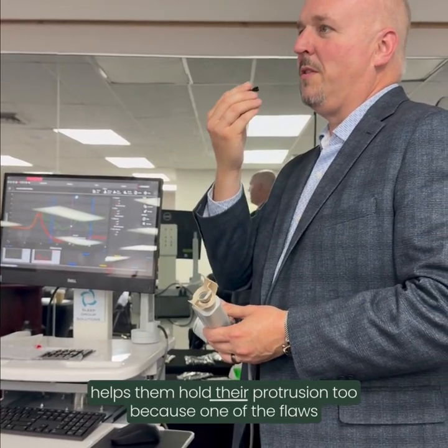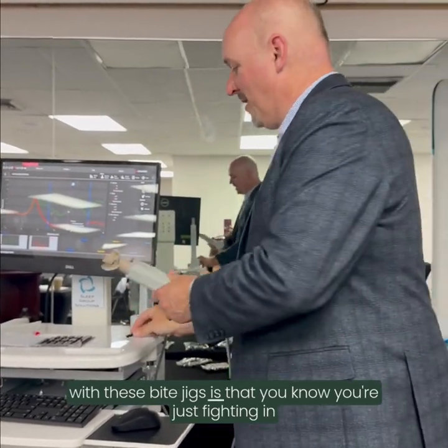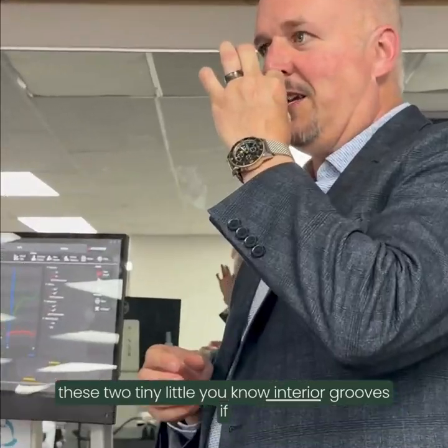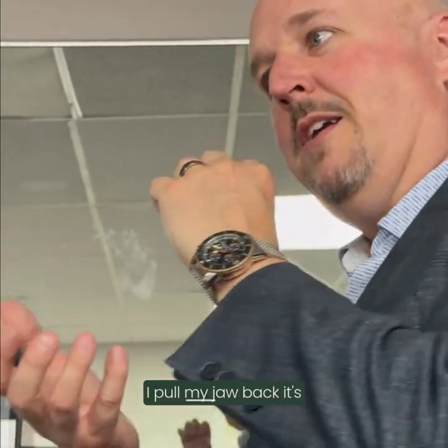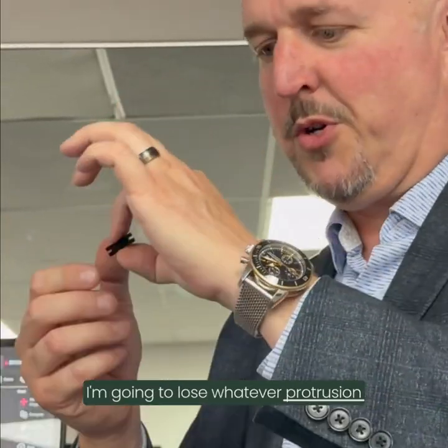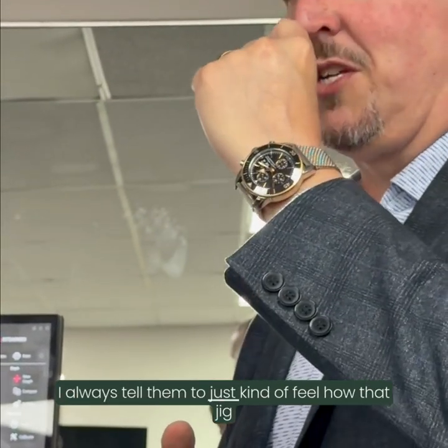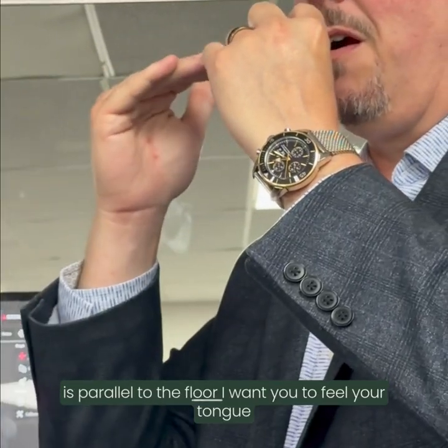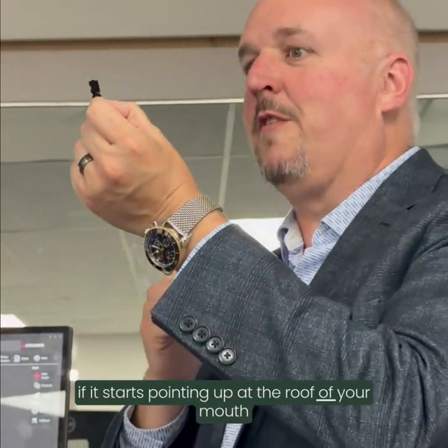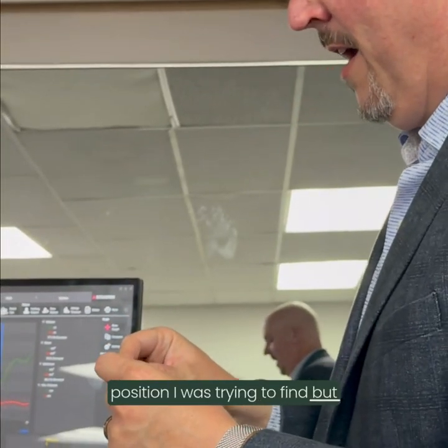That helps them hold their protrusion too, because one of the flaws with these bite jigs is that you're just biting in these two tiny little anterior grooves. If I pull my jaw back, it's just going to flip that jig, and I'm going to lose whatever protrusion I was trying to achieve. So I always tell them to feel how that jig is parallel to the floor. I want you to feel your tongue under there and keep it that way. If it starts pointing up at the roof of your mouth, I know they've pulled back and they're lost whatever position I was trying to find.